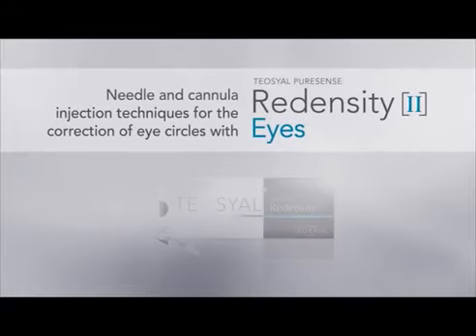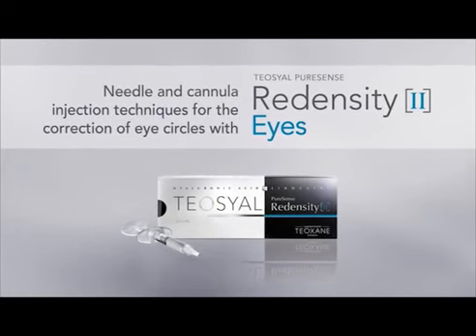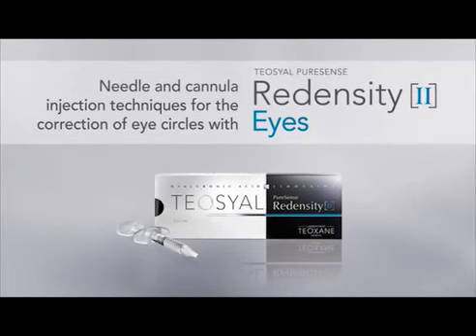This film presents the different injection techniques with needles or cannulas with a new filler, Teosyal Redensity 2, developed specially for the correction of the suborbital region.